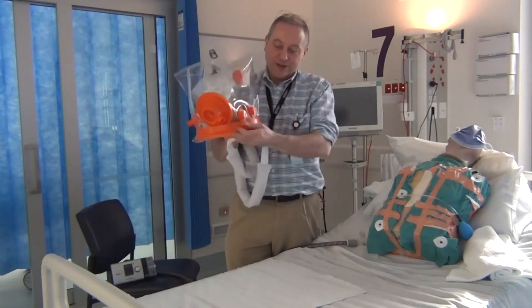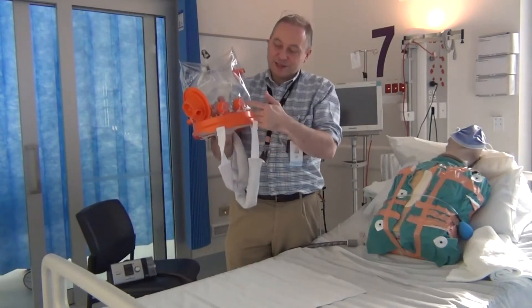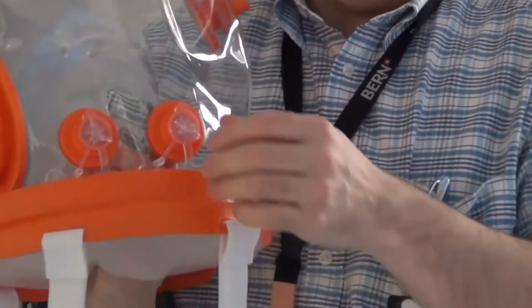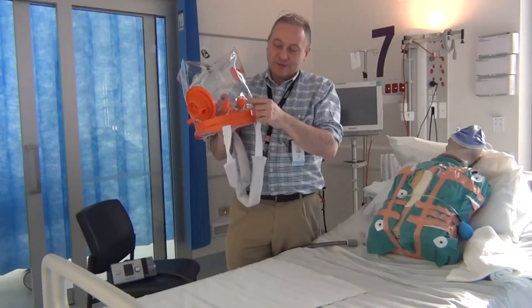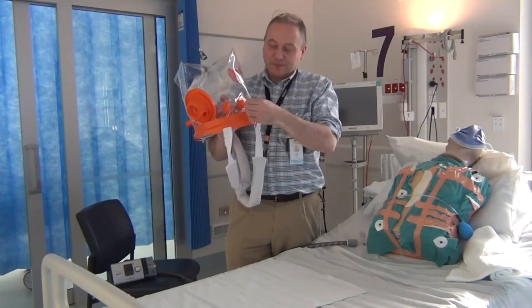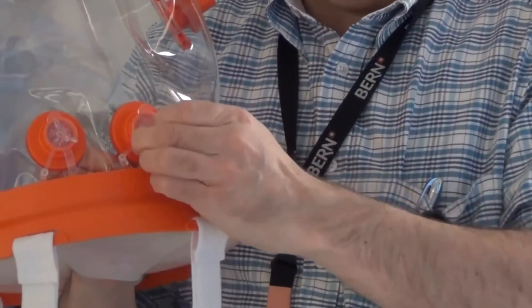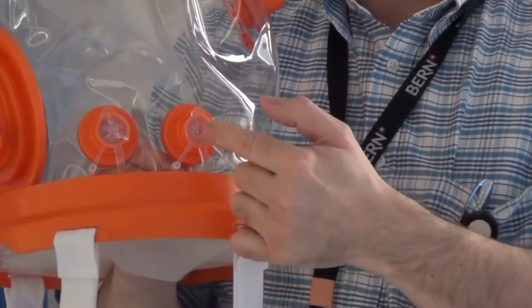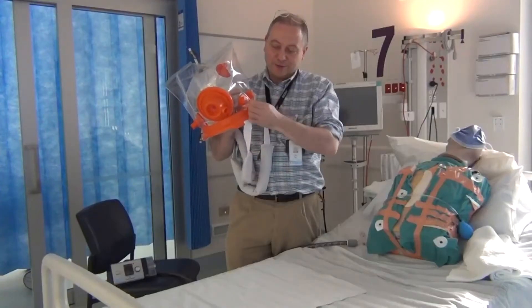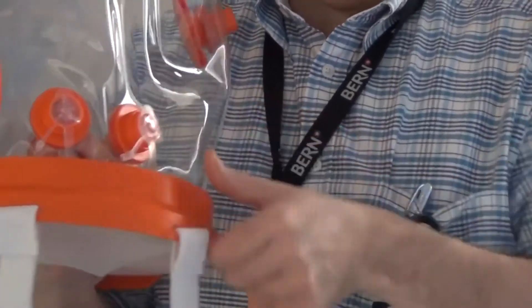The front of the helmet is around here and you can tell that because of the two ports we have. These ports can be used to place feeding tubes through into the patient, and they have little seals that go in so that when they're not being used for feeding tubes or straws — if a patient's drinking, you can have an extended drinking straw — the bungs should be in place.